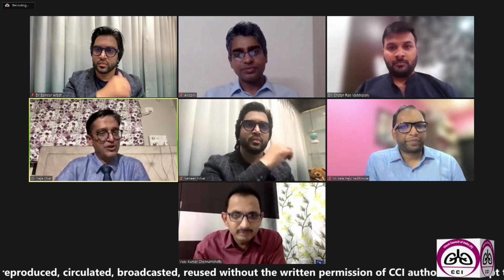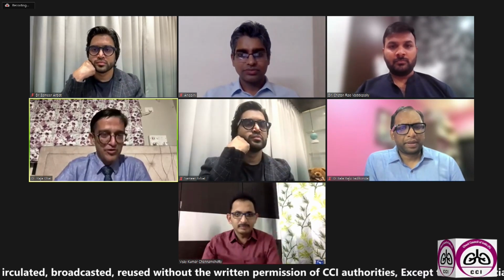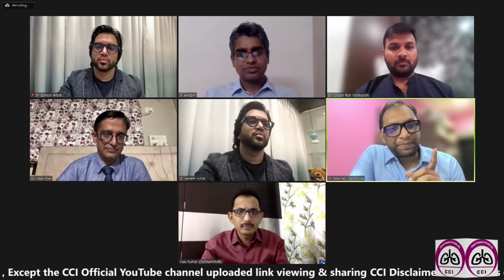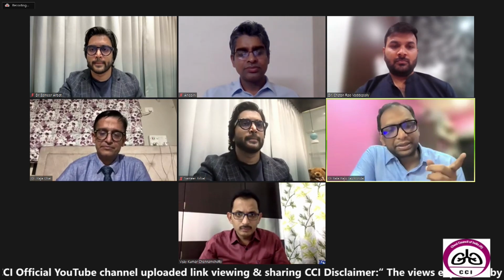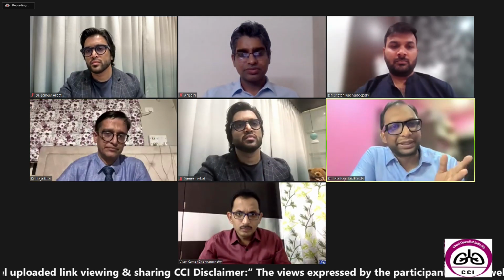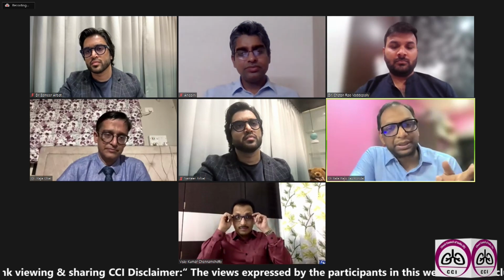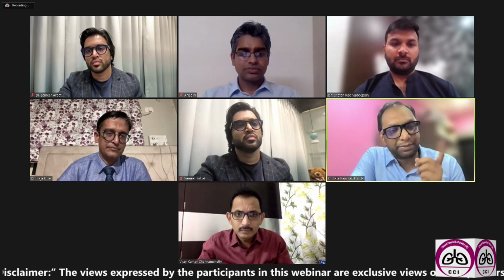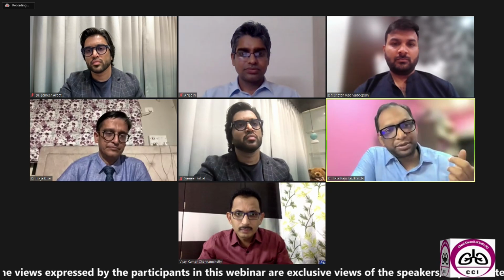Sure. Absolutely. I think we have actually got it from our gastro colleagues. I don't know whether Bala, you have any thoughts? Yeah. If you look at the cryo unit, what we are using now is the cryo 2 unit, which is specifically designed for pulmonology. The previous unit, the basic cryo unit, was not designed for pulmonology. It's basically designed for ENT, gynec, and dermatology. Sure. So this was used for cervical lesions, for chronic cervicitis, for all those diseases. They used to do cryotherapy in gynec diseases, and also for ENT, they used to do a rigid bronchoscopy cryo extraction debulking with a rigid cryo probe using a rigid bronchoscope with the same unit.